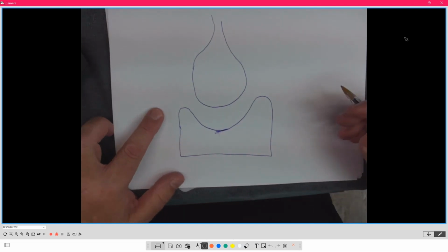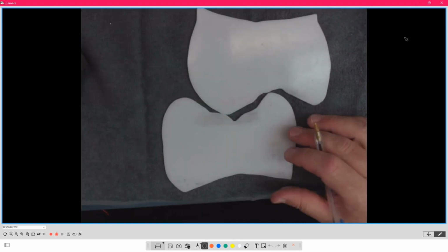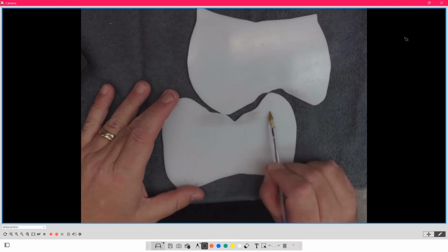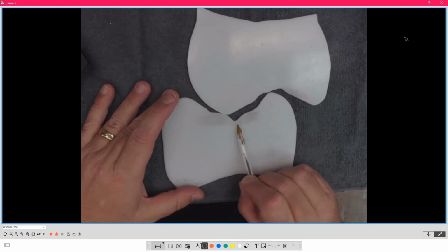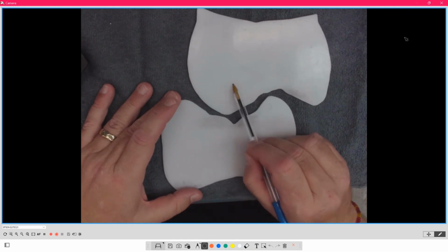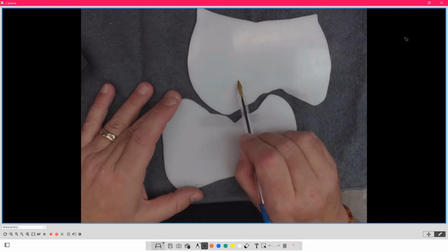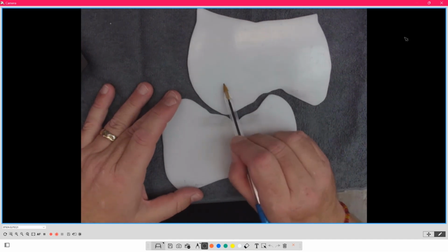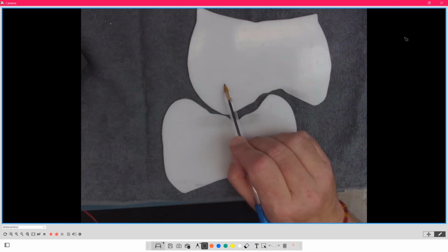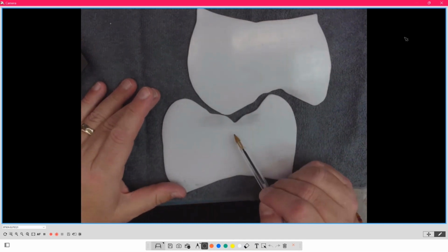So it's a food terminology of a mortar and pestle, but our teeth are designed like this. From a teeth concept, you have the bowl, which is the lower, which holds the food. Here is the big hammer. It's the lingual cusp of the upper posterior teeth. There's the buccal cusp, and this sits in here. So it's a larger cusp design compared to a milling tooth, which is the 0, 10, 20, 30 degree teeth. And this is what pulverizes the food.